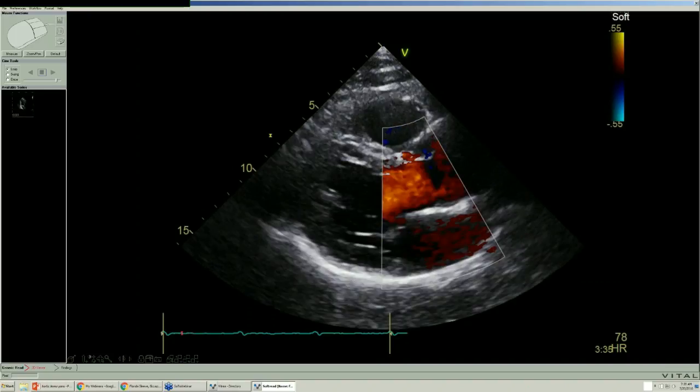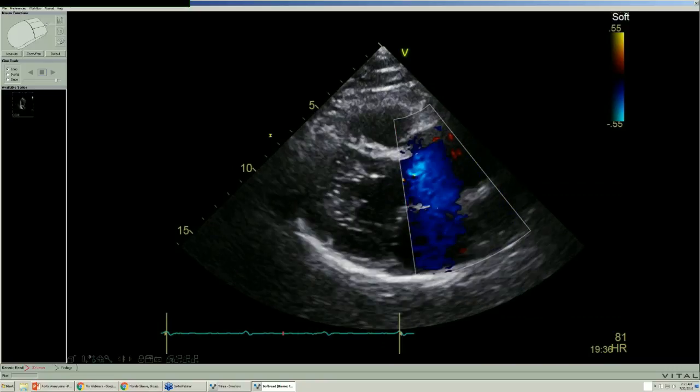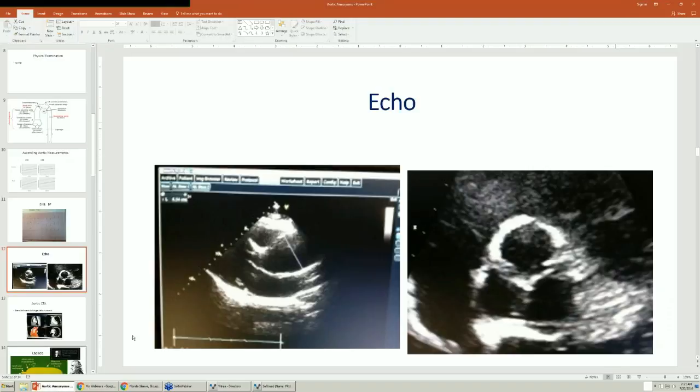And so it looks like we come to the end of that scroll. And you can see, actually, sometimes you can go up to the sternal notch and make pictures here and get some pretty good pictures. And so Ben is becoming very familiar with this technology. And so let's show you the next part, which is the aorta. So we'll go back to my slide deck, which is somewhere here. There we go, slide deck.